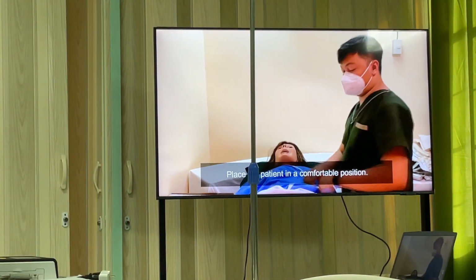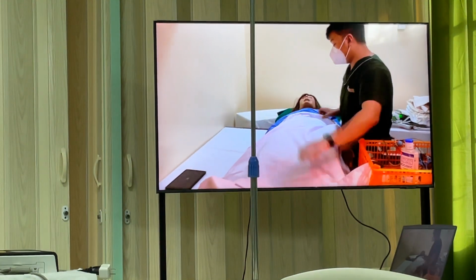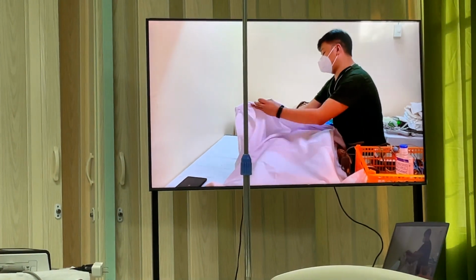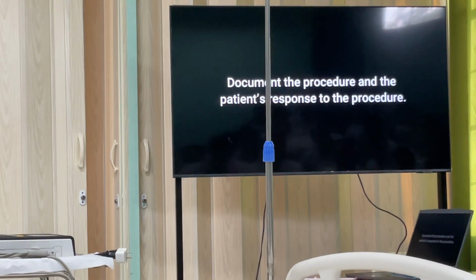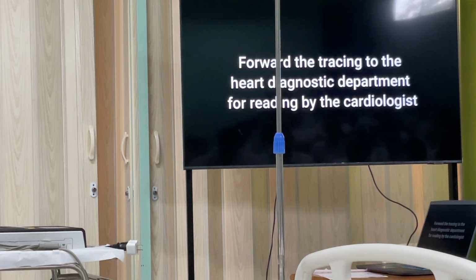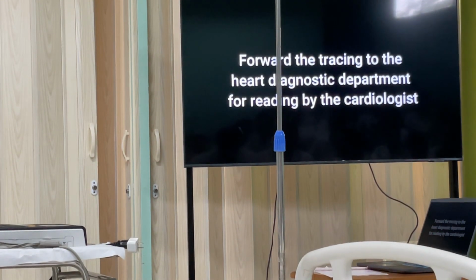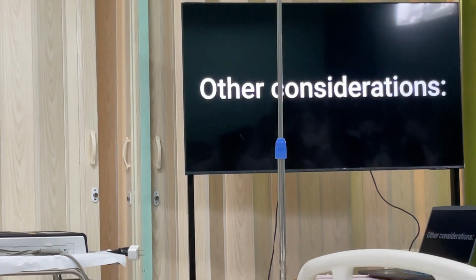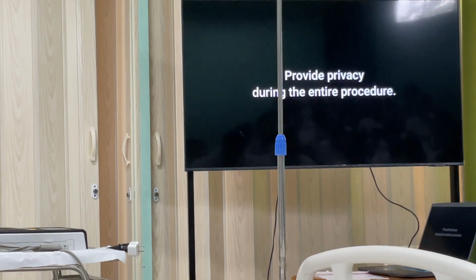Place the patient in a comfortable position. Document the procedure and the patient's response to the procedure. Forward tracing to the heart diagnostic department for reading by the cardiologist. Other considerations. Provide privacy during the entire procedure.